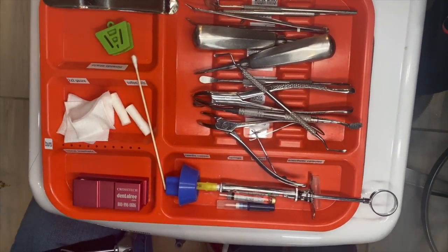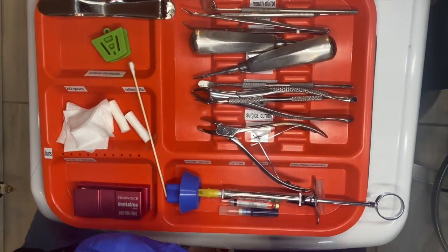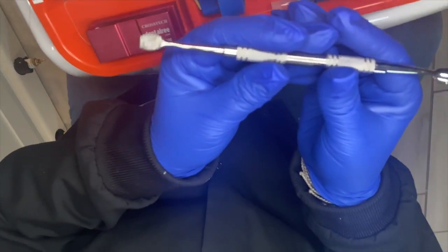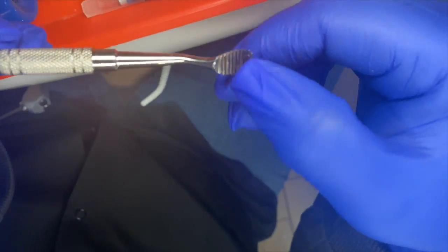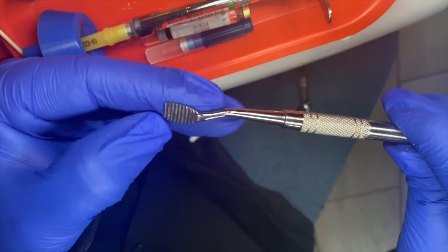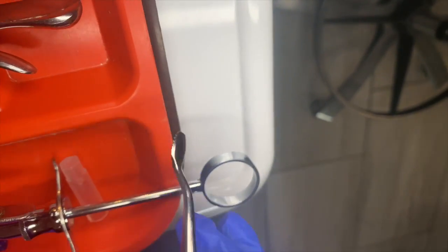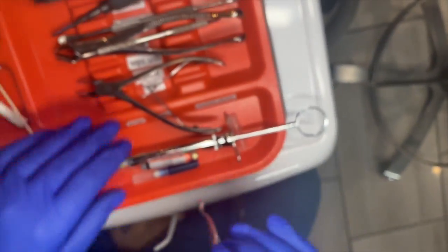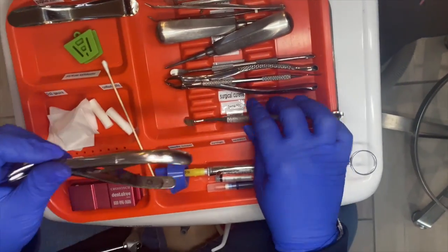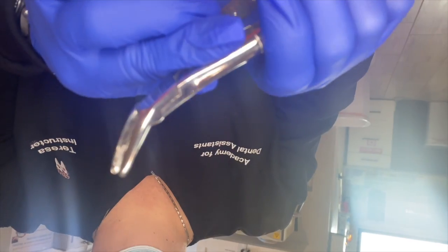Once the tooth is removed, if there is rigid bone or sharp bone around the sides of the extraction site, they would use a bone file. The bone file is just like a file — they would use it to remove and shape the sides of that site. They could also use the rongeur, which is sharp and is used for cutting the bone.